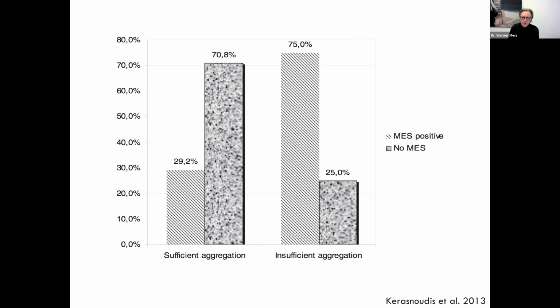And think about it. Think about a patient with hypertension. If somebody comes in and you give medication, you wouldn't say, okay, goodbye and good luck. You would say, either buy an instrument to measure the blood pressure daily at home, or at least come in regularly. You are going to check the blood pressure and whether the medication is working or not. This is not what we are doing with atherosclerosis. And here we have a very nice situation where we could do it.